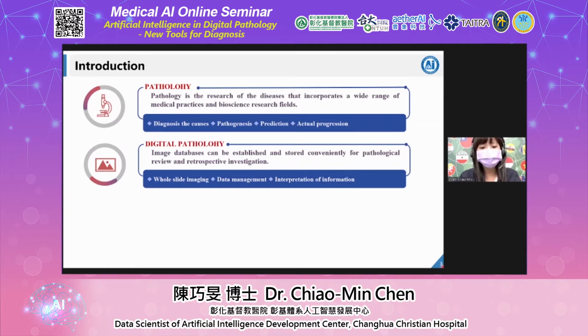Now let me talk about digital pathology. In fact, it first converts traditional tissue slides into digital slides, which can be conveniently stored for pathological review and retrospective investigation. It's conceivable that in this way, internal medicine, surgical, radiology, and oncology physicians can discuss at the same time in different spatial environments and jointly provide patients with accurate diagnosis and treatment methods. Of course, the patient's waiting time for reports is greatly shortened.